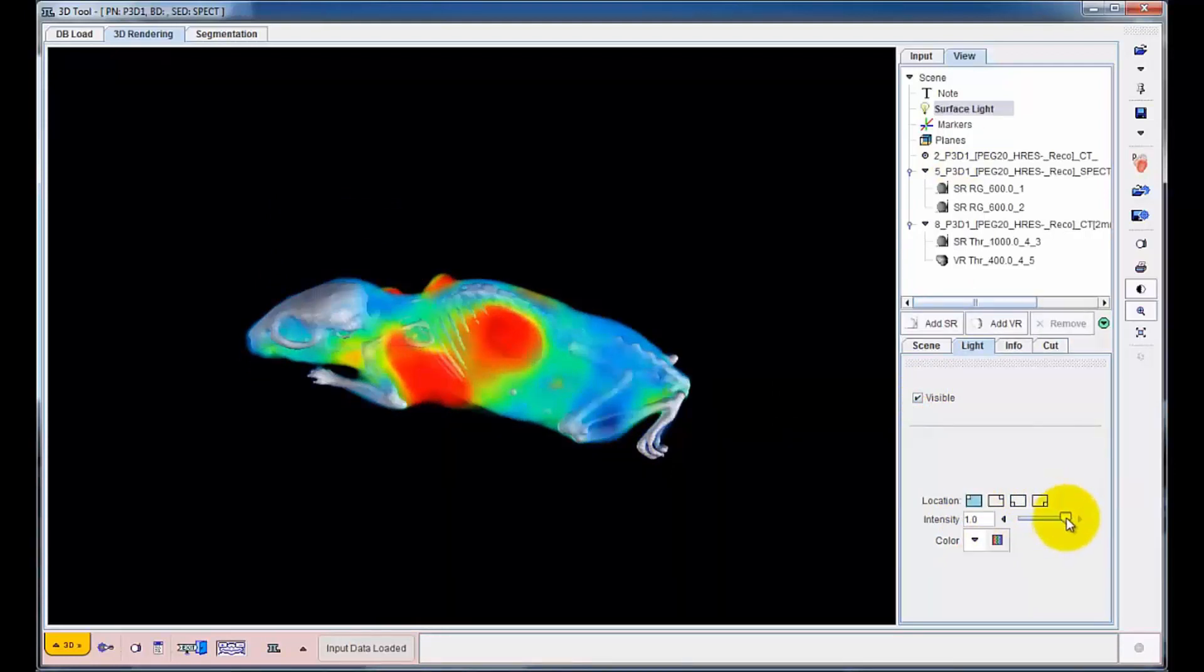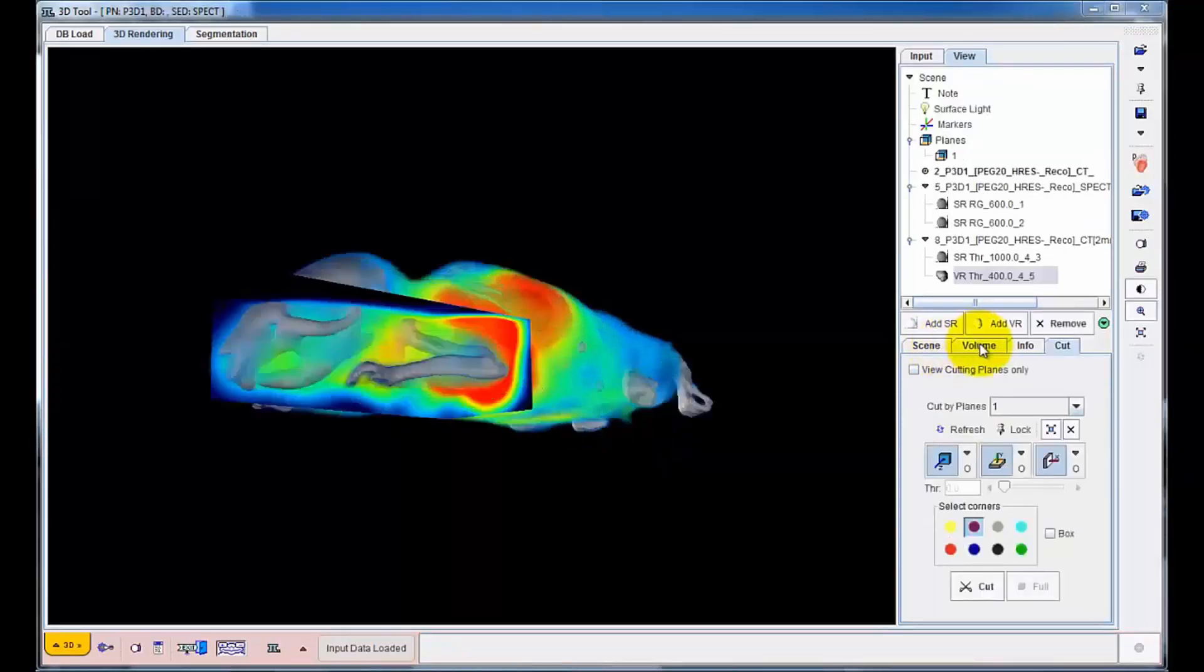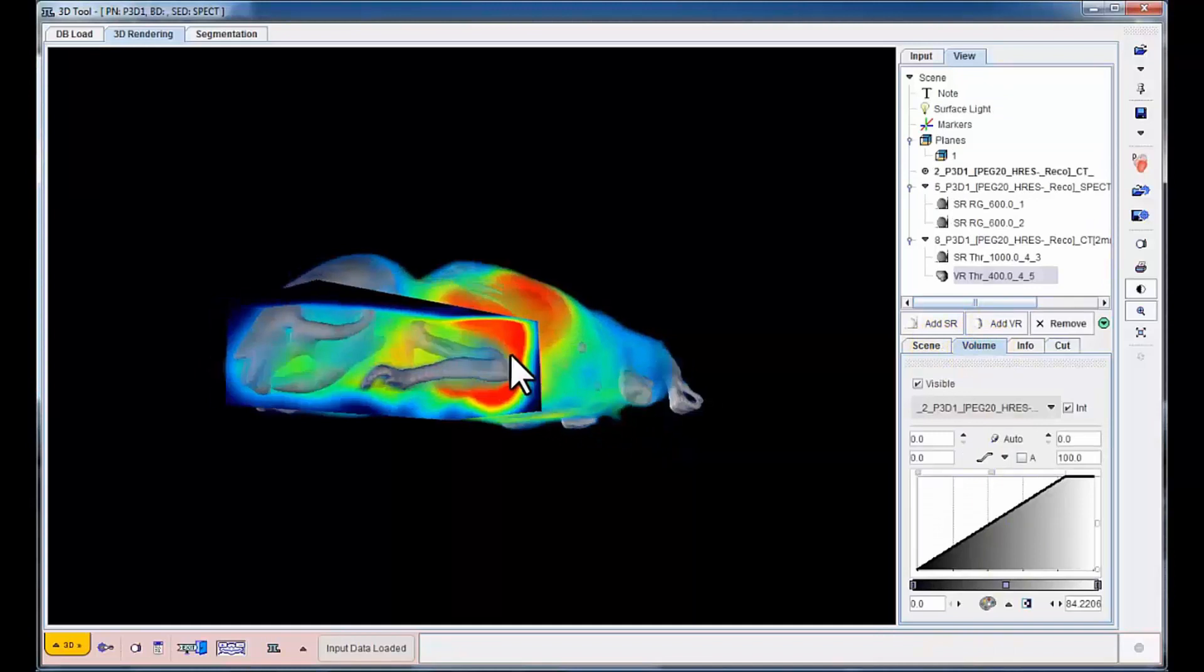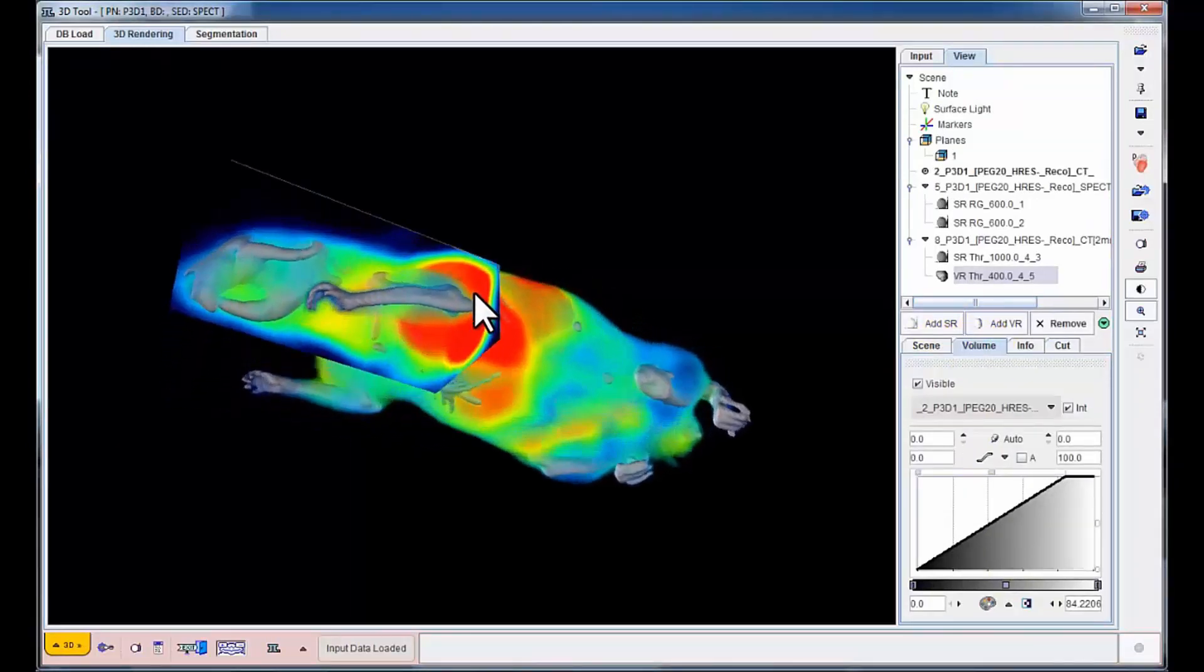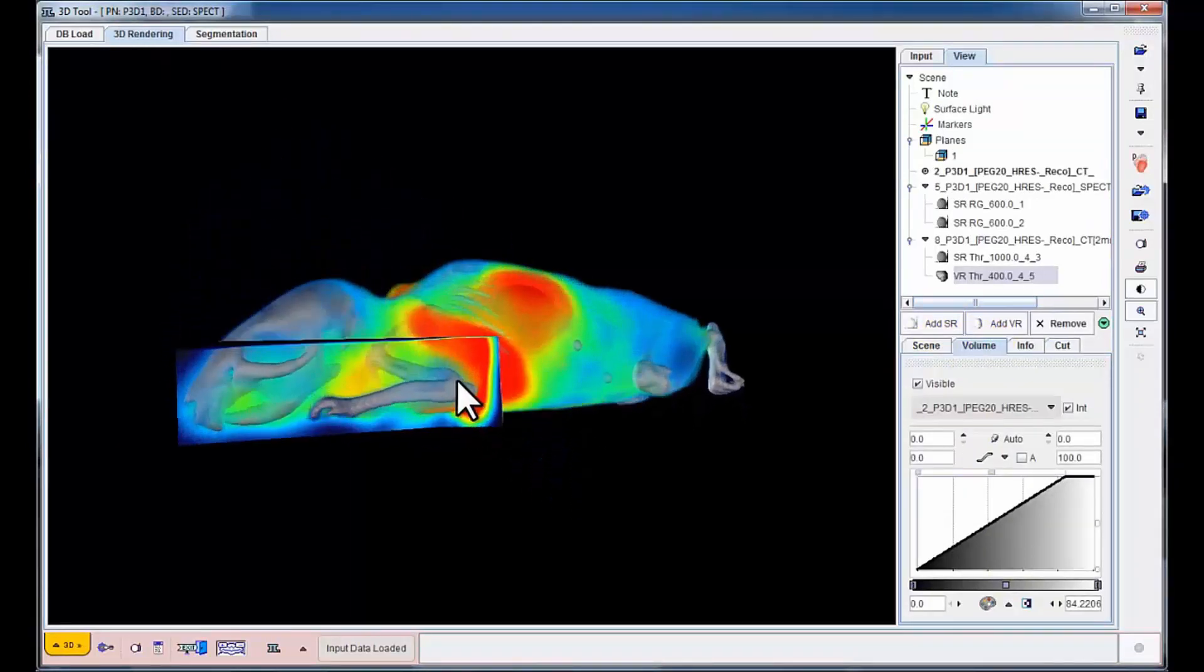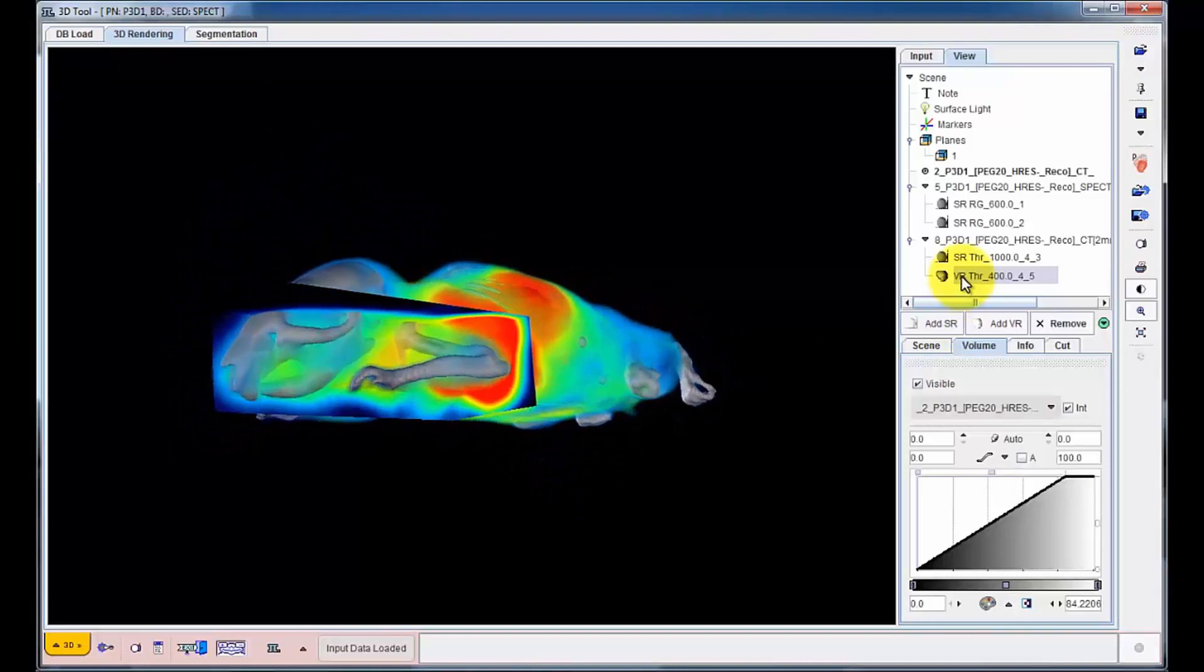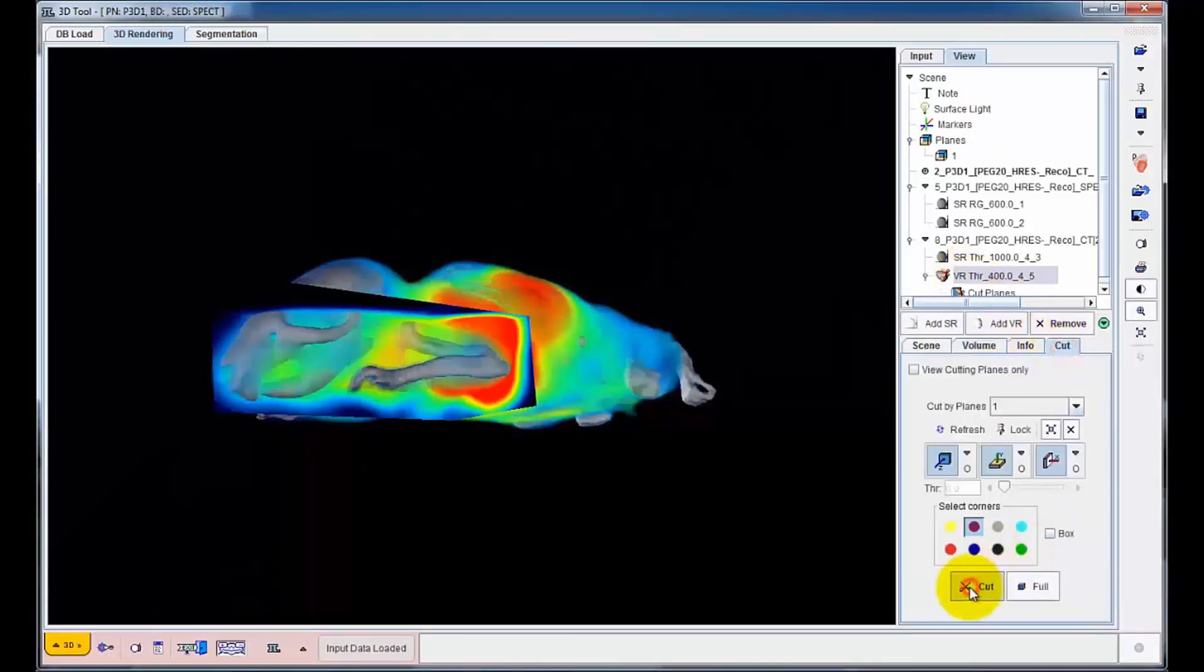A further visualisation option is the removal of parts of an object to expose inner structures. In our example, a quadrant has been cut out of the body rendering such that the left foreleg is isolated and the tumor is better resolved in depth.